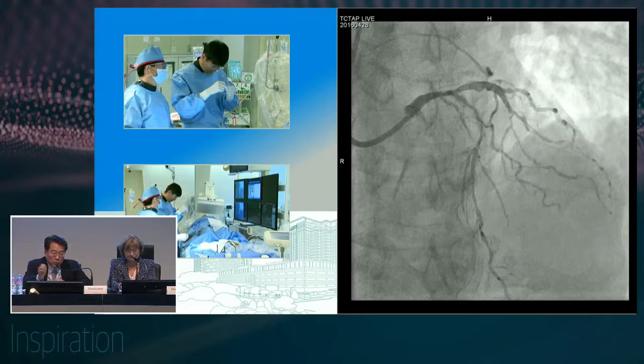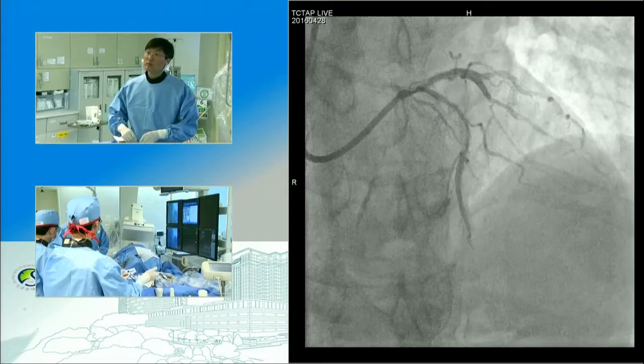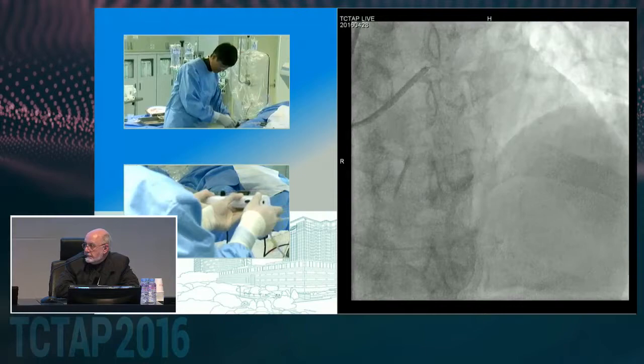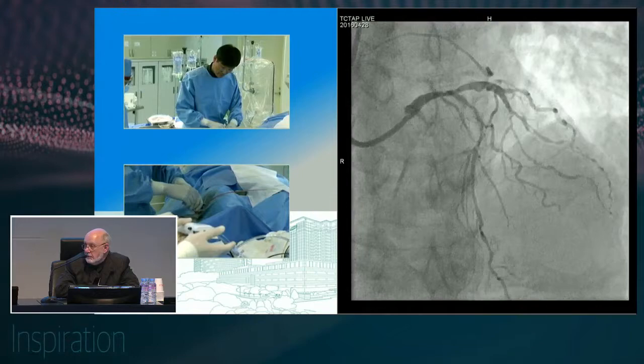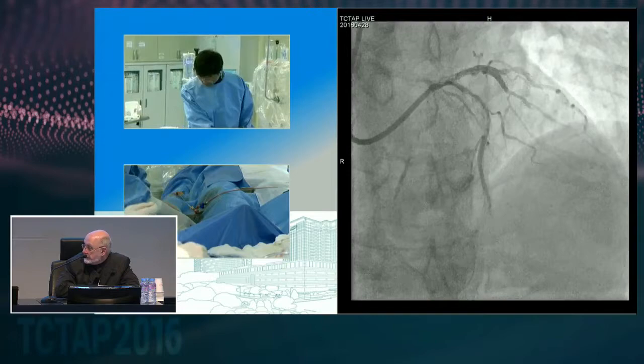Rotablator is one of those procedures where if you asked three interventionalists, you would get five opinions. We almost only use a single burr, and that's based on 20 years of experience in which what you're trying to do is modify the most superficial elements of calcium, which are the toughest and the most resistant. And so usually if you get reasonable ablation, like you saw here by ultrasound, with a single burr, we would typically stop. But of course, we would always pre-dilate, and that allows us to test whether or not things expand nicely. And if it doesn't, then you can always upsize.